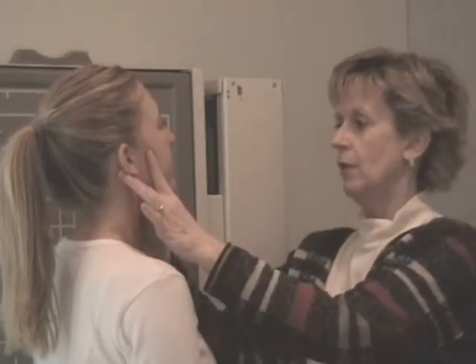I'm looking at her eyes to the lateral edge of the skull, and I'm making sure she's not tipped. And this would be C7. This would be a lateral cervical spine. You need all C7 on there.